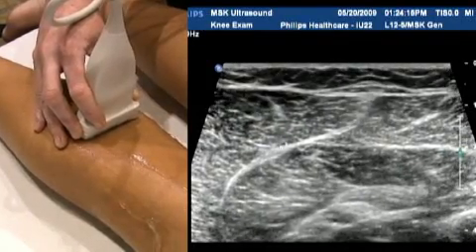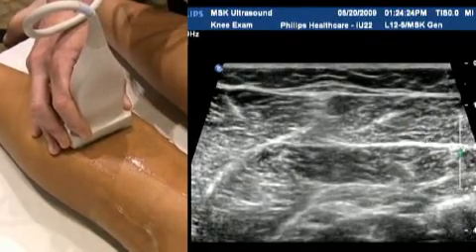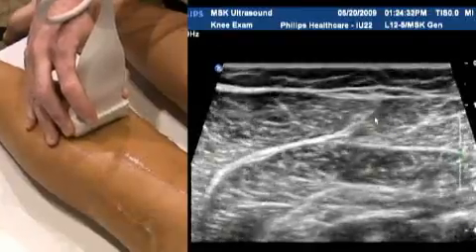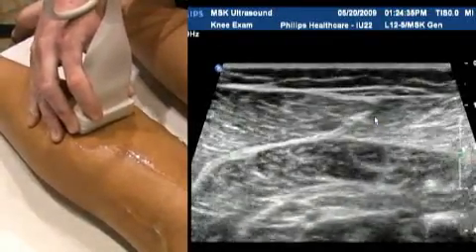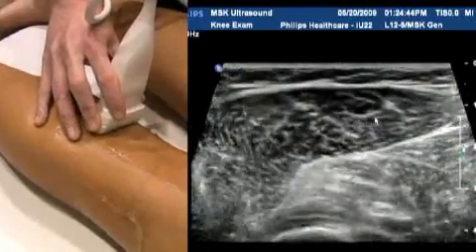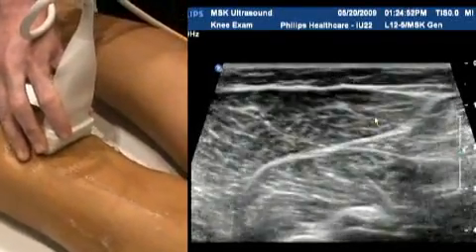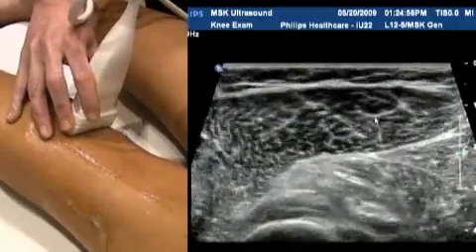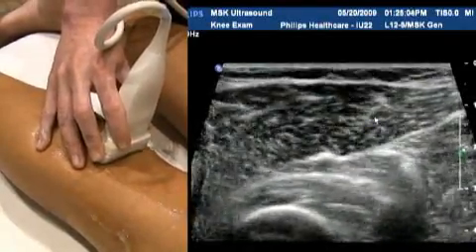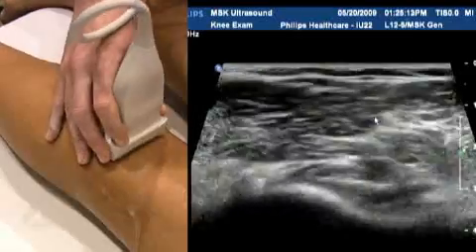Medially we have the medial gastrocnemius muscle — this big powerful calf muscle — with the lateral gastrocnemius as its paired structure, and the soleus underneath: a trio of muscles to be familiar with. Just scan through, making sure everything looks homogeneous. The veins contained within the muscle should be easily compressible — another cause of calf pain is thrombosis in the muscular veins, not necessarily the deep veins, so it's important to cover that also. You can see how lovely and homogeneous these muscles are, with no areas of increased signal or edema, and no signs of atrophy.